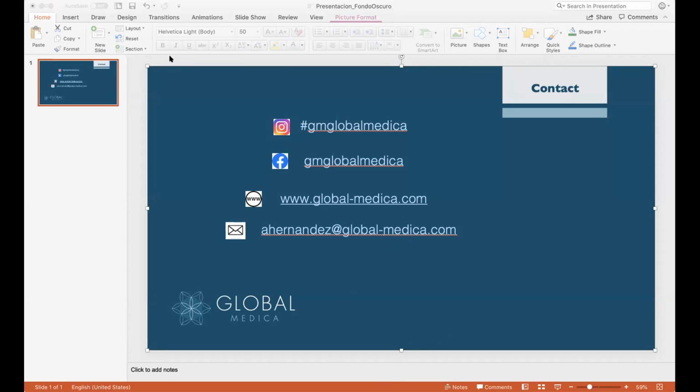There's one last question from Miss Zogo: what phases are best for ejection fraction? Maybe Rafael can answer. Hello, Susan. How are you? Thank you for the question. I would recommend you to have from 5% to 95% with a 5% increment between those phases. If we give this information to the system, it will be more accurate in identifying the ejection fraction, the end of systole and end of diastole. Hope it helps.